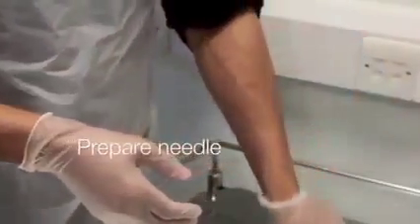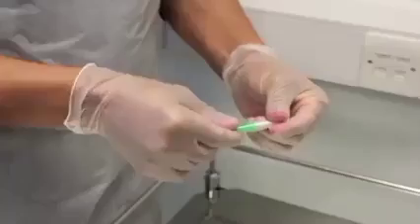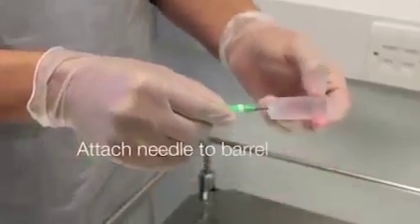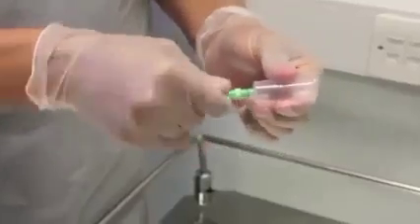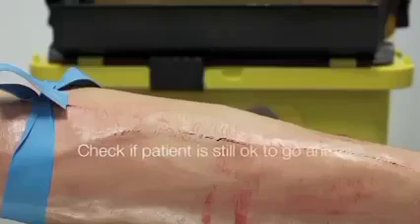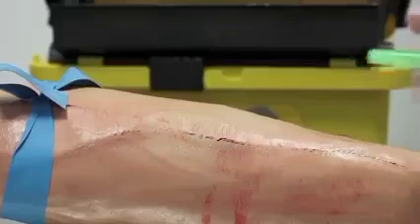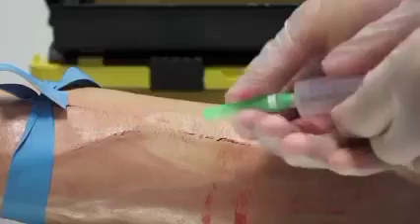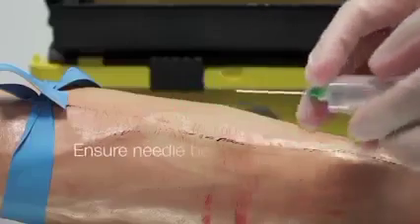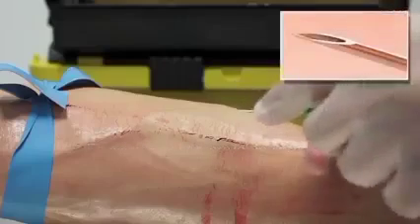I'm now going to prepare the needle and screw it into the barrel. I'm now going to insert the needle into the vein — it should feel like a sharp scratch. First, take the sheath off the needle and make sure the bevel is pointing upwards.